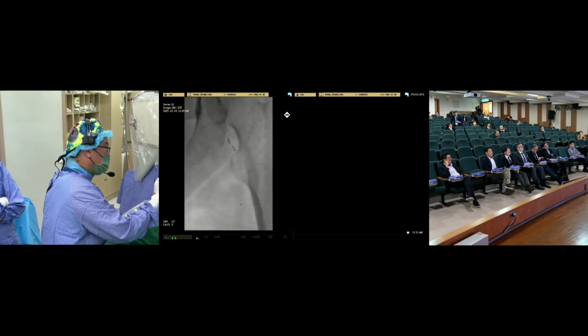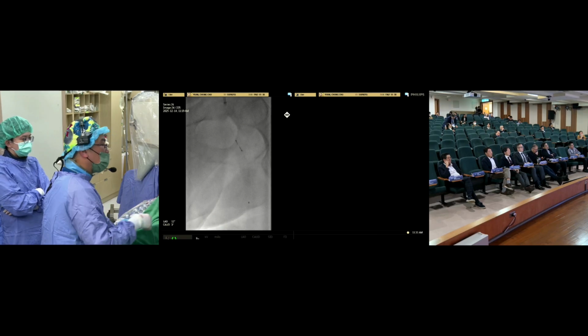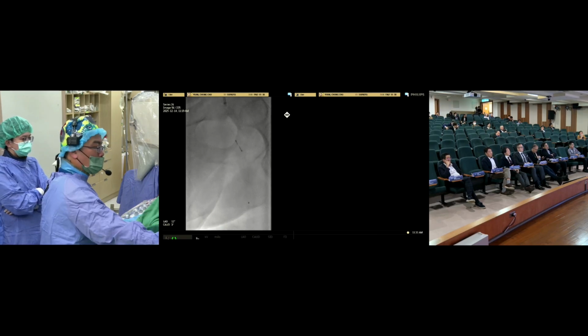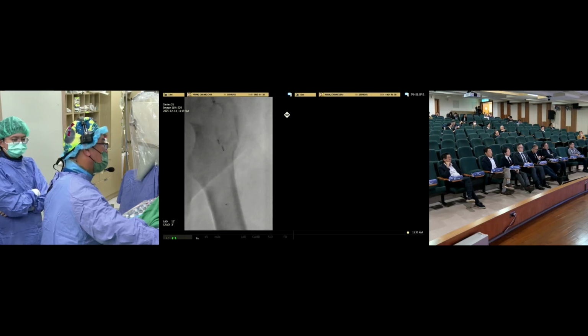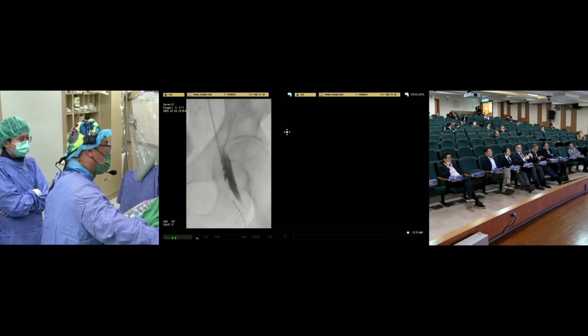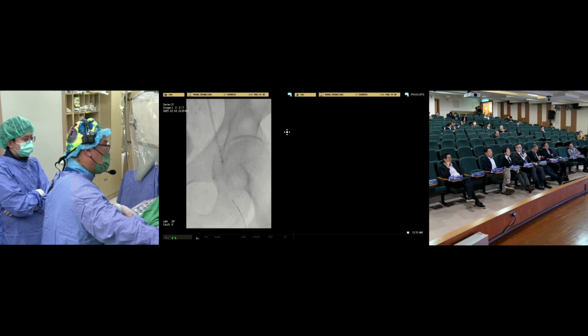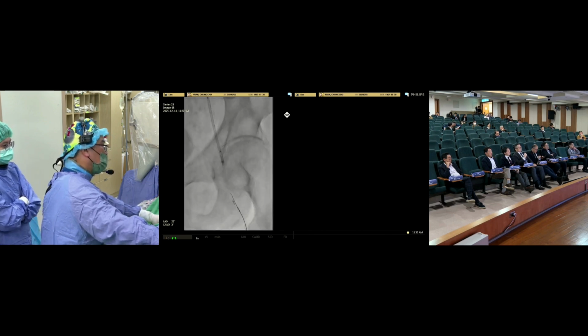I think the distance is much shorter between the antegrade and retrograde routes, and then we tried to bed it. Yes, it's very short. So we keep the antegrade CXI as a guide and go parallel retrograde with the Astato 40.